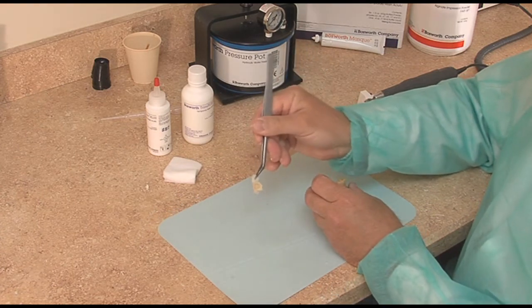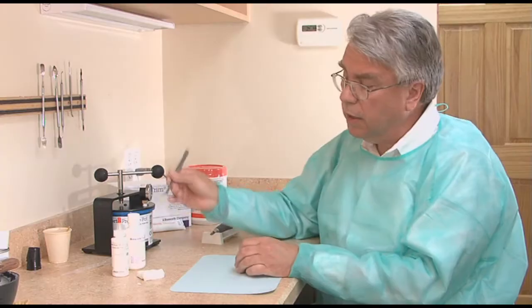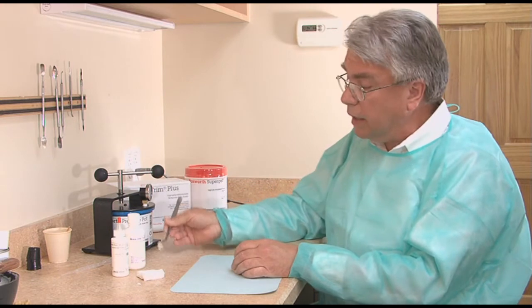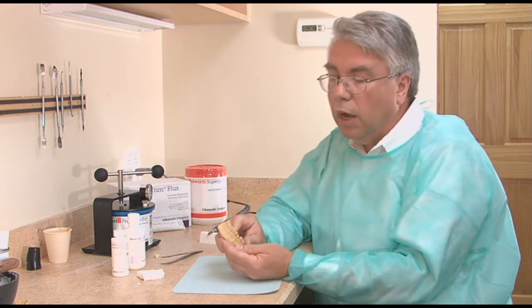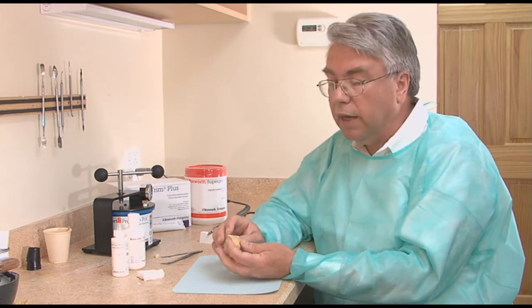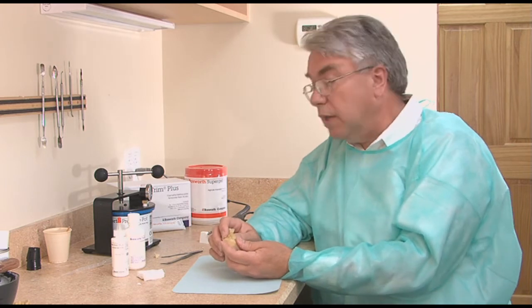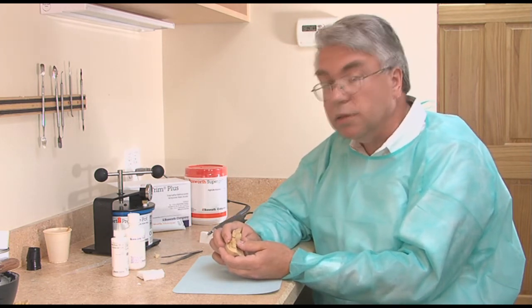You can look at the detail — at this point I would use the pressure pot and place it in there. After it's sitting in the pressure pot, I would have the patient rinse out because it does generate some heat and the taste is not the best. I want them to relax their muscles and then sit back while my assistant cleans up. We don't want the lubricant on when we cement the temporary crown because it will hinder its attachment. She will clean off with either hydrogen peroxide or even better some diluted mouthwash.